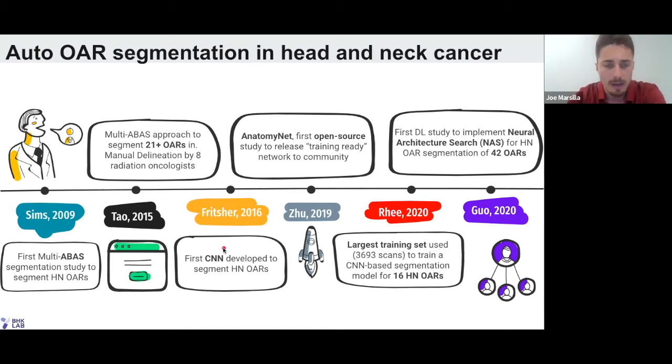And obviously, as discussed in the technical session, these networks can be used to detect class values at the pixel level, which is perfect for auto segmentation, especially in terms of radiation therapy, because there's a lot of different volume classes that we want to segment for radiation therapy.